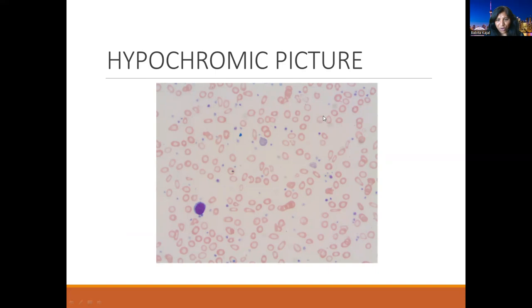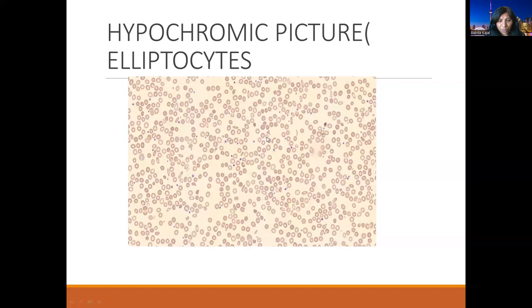This picture is quite pale. First, the number of RBCs is quite low, and all those RBCs are almost empty — you can see only the rim, as the central pallor is quite large. We also have small microcytes. This is a severe microcytic hypochromic picture, mostly seen in severe iron deficiency anemia. Along with those hypochromic and small cells, we also see elliptocytes and microcytes — this is a hypochromic picture with predominantly elliptocytes.